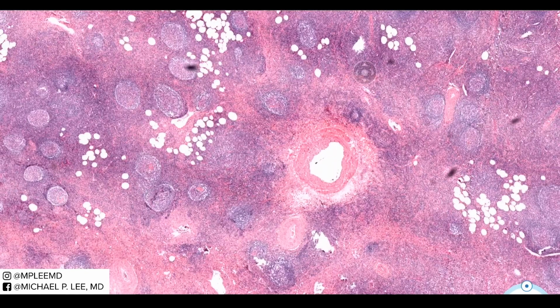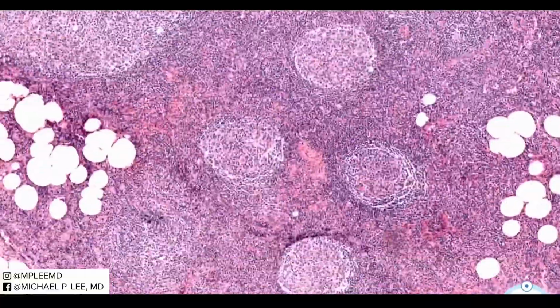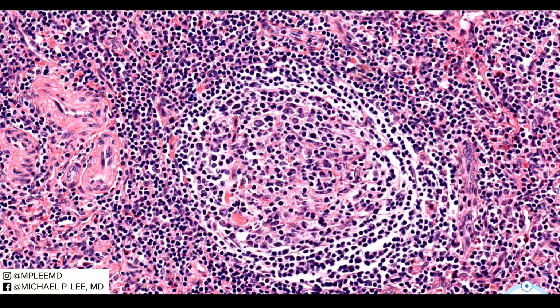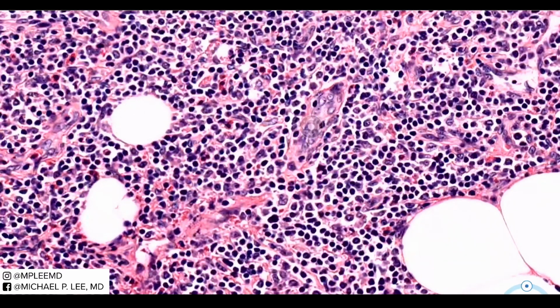It does have a vessel in the middle, but any tissue requires blood vessels to support it, so you would expect at least some blood vessels, but far fewer vessels than the other case, right? We don't see any vessels intervening here. And as we go to higher power, you can see that these are beautiful lymphoid aggregates. We don't really generally see that in angiolymphoid. And again, lymphocytes and eosinophils. So from a high power perspective, these two lesions look almost identical. You can't tell the difference.